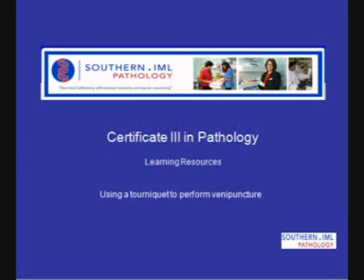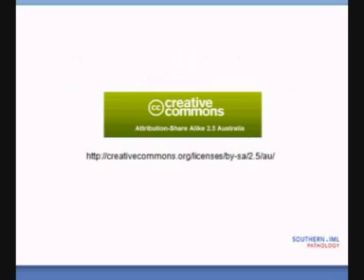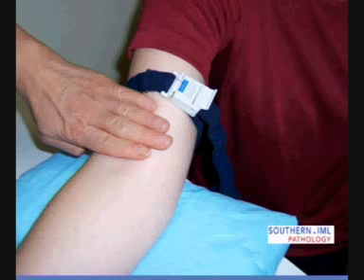Using a tourniquet to perform venipuncture. A tourniquet is used to enable a collector to visualise veins. Measure approximately three to four fingers above the client's cubital fossa, wrap the tourniquet around the arm above the chosen site, and clip the apparatus into place.